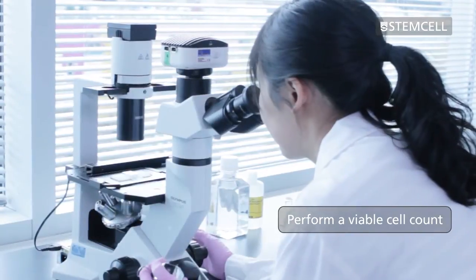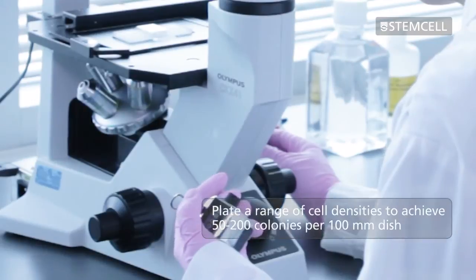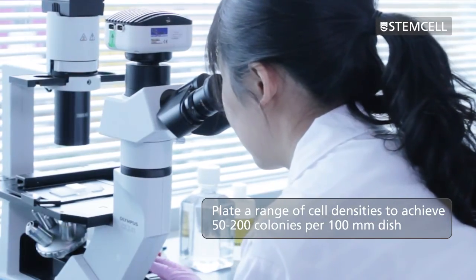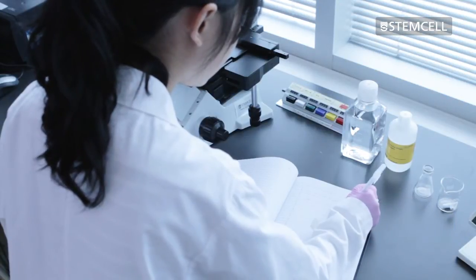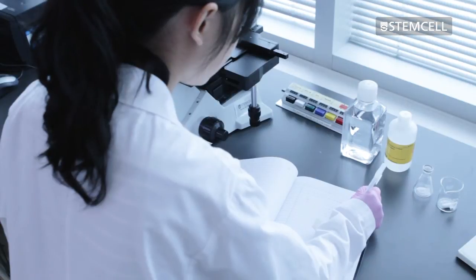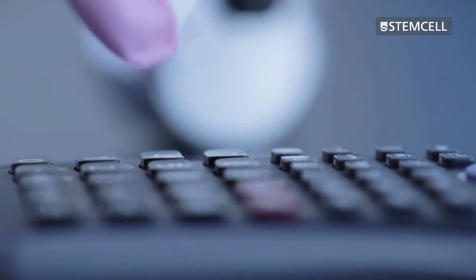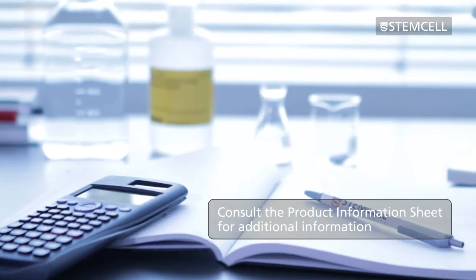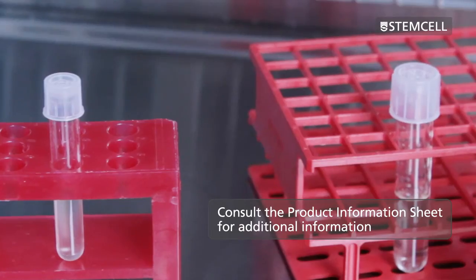Perform a viable cell count and calculate the number of cells to plate. Plating at various cell densities is recommended to achieve 50 to 200 colonies per 100 millimetre dish. The cell concentration used for plating will need to be determined experimentally, as it will vary depending on the transfection efficiency, the condition of the cells, etc. Consult the product information sheet for your specific medium for additional information.